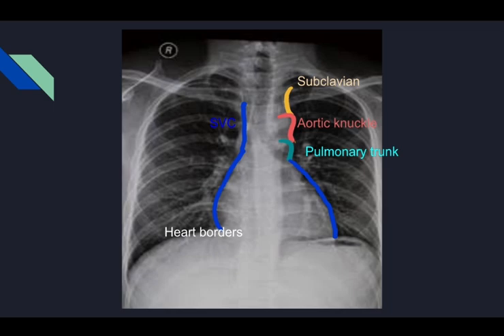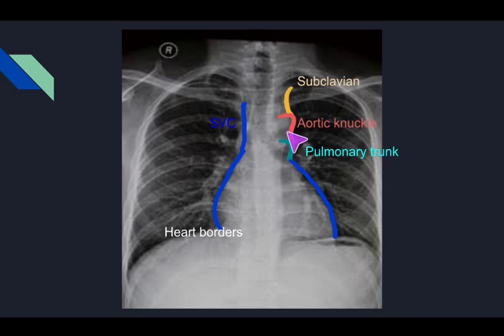Next we have to see the mediastinum. It is very important to know the anatomy of the mediastinum because so many structures are located here. On the left side, the subclavian vessel is seen as a convexity around the clavicle. Just below it is the question-mark-shaped aortic knuckle, which is the aortic arch. Below that is another convexity — the pulmonary trunk or pulmonary bay. Between these two is an important area called the aortopulmonary window, which is a key landmark for mediastinal lymphadenopathy.